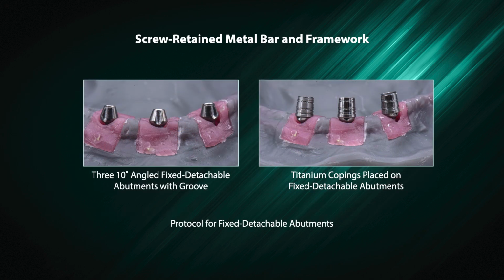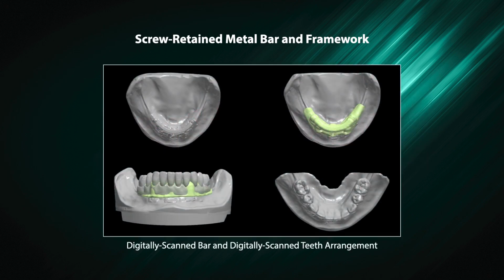Protocol for fixed detachable abutments. On the left are 3 10-degree angled fixed detachable abutments with groove. On the right you can see titanium copings placed on the fixed detachable abutments. Digitally scanned bar and digitally scanned teeth arrangement.